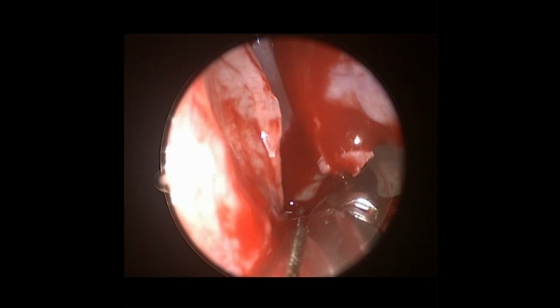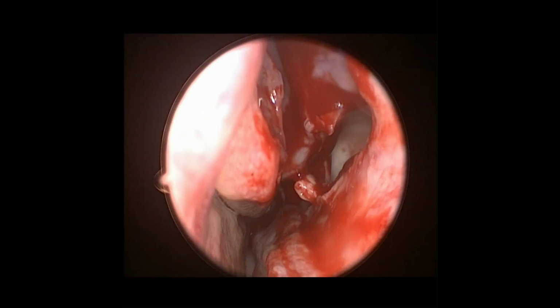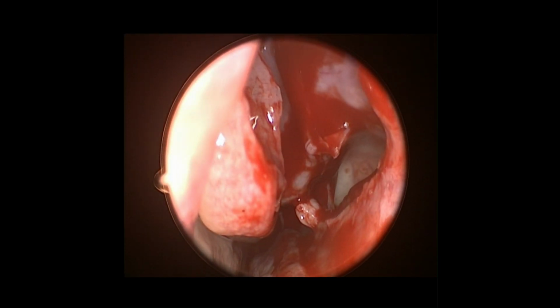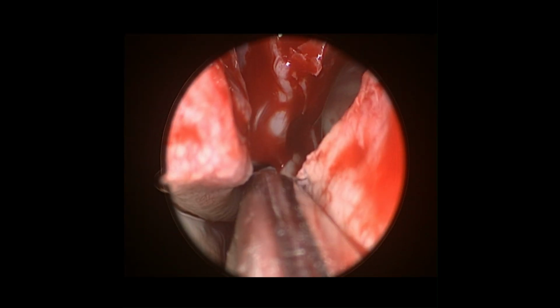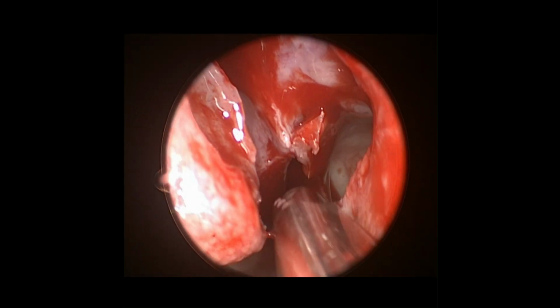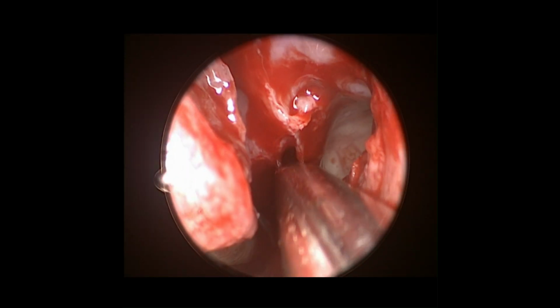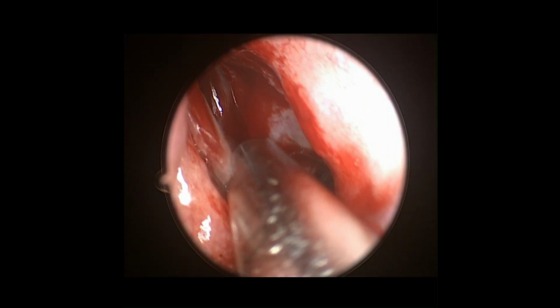The horizontal portion of the uncinate is medialized and cut at the posterior superior continuity with a through-cut or with endosinus scissors, and removed with a debrider to create a wide maxillary antral opening. The two-dimensional space between the bulla and uncinate process is also called the hiatus semilunaris inferioris.